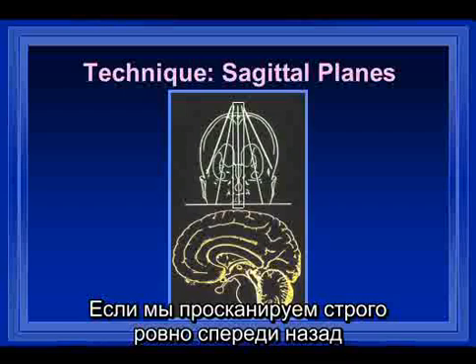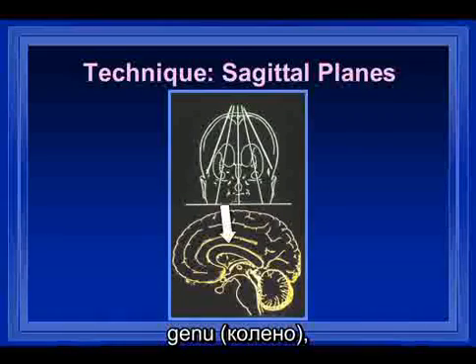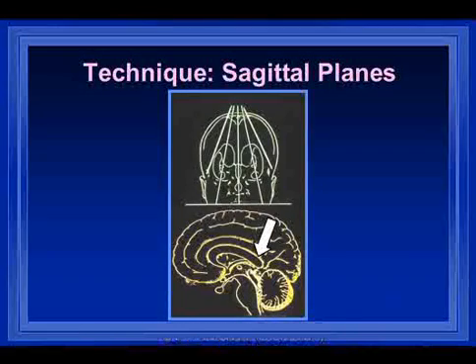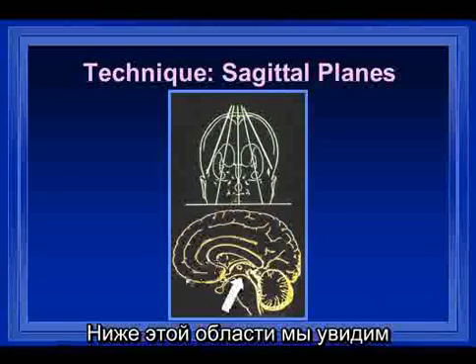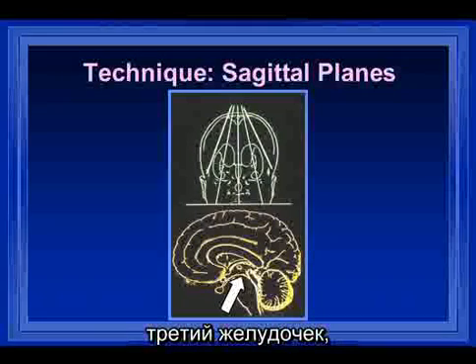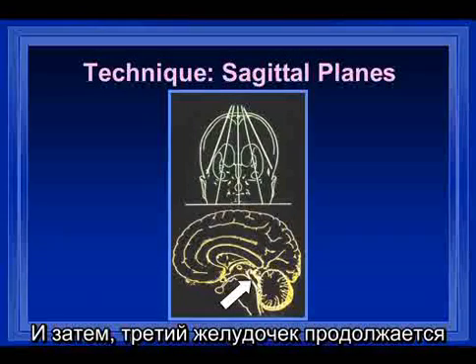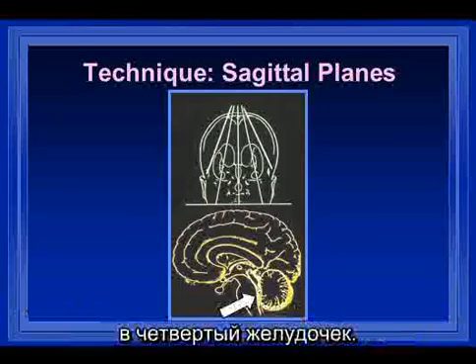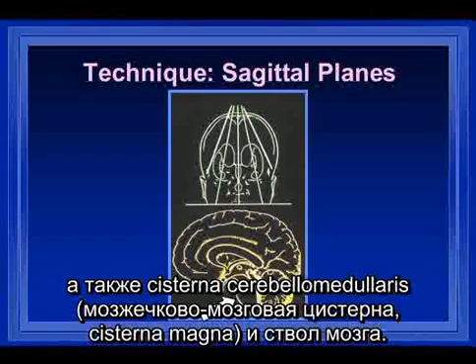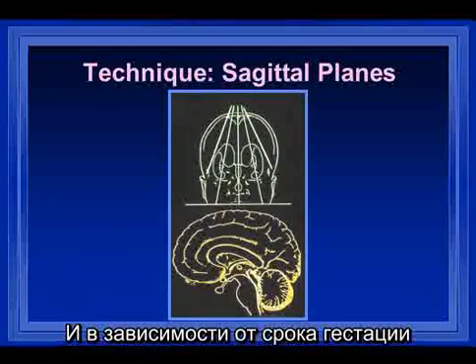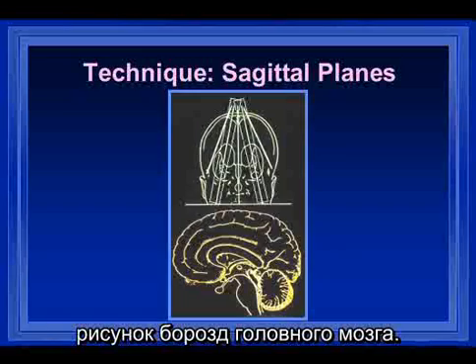As we scan in a straight anterior-posterior plane in the midline, we will see the corpus callosum — the genu, the body, and the splenium. Just below the corpus callosum we will have the cavum septum pellucidum, and below that the third ventricle. We will see the masa intermedia when that ventricle is enlarged. This continues through the aqueduct of Sylvius to the fourth ventricle. We will visualize the cerebellum, the cisterna magna, and the brain stem. Depending upon the gestational age of the infant, we may or may not see the convolutional markings of the brain.